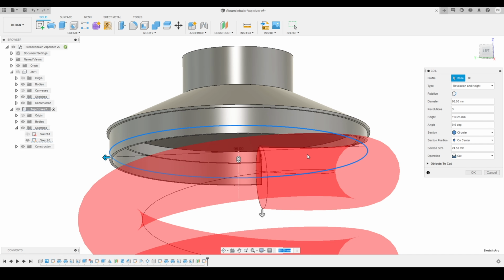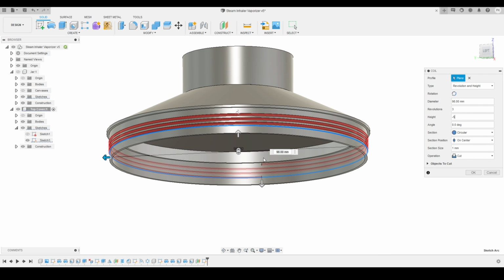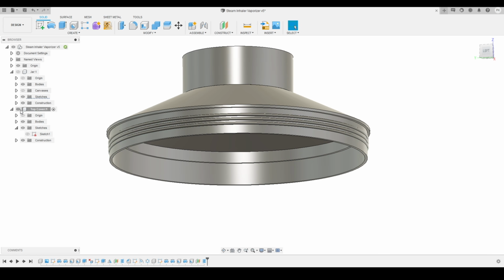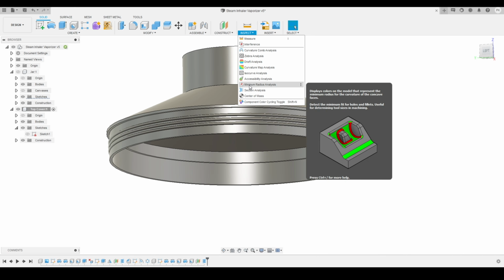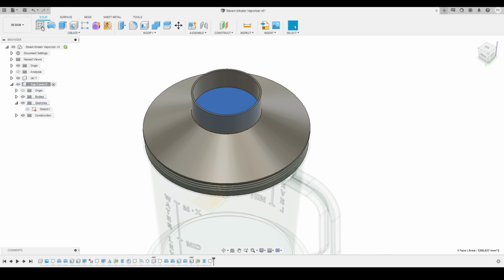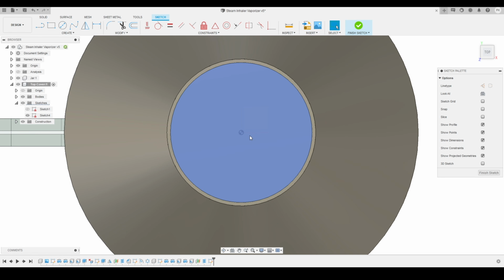Now I have to specify the section size for this coil, and then I have to specify the height. I just made it -5 millimeters, and we'll make sure that the operation is join, and press OK. So here you can see I have just created a thread on our top cover. Now again I will activate my top cover component and select this plane as a sketch plane. Here you can see I have activated the sketch plane, and now I will start creating circles.